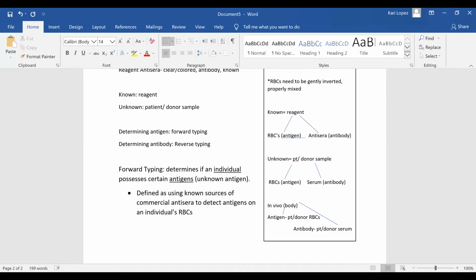And see, all of this is just different terminology for the same thing. The anti-sera that you're generally going to use is your anti-A and anti-B, which again are clear, but they dye them yellow and blue to help prevent them getting mixed up with any other anti-sera. Blood type is so important to get right, so you don't make mistakes, because it can get deadly really quickly.